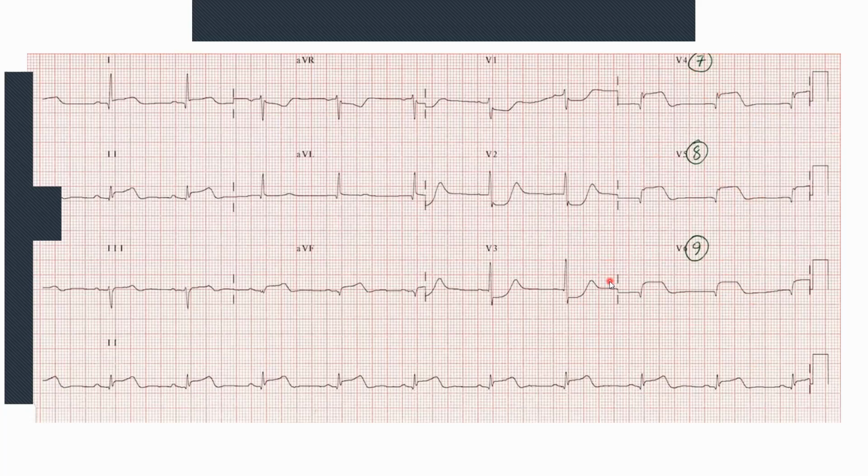Why is this important? It's important in terms of prognosis. It's important in terms of treatment. It's important in terms of how your cardiologist is going to treat the patient. So that's what I would suggest that you make sure that you have a look at and see.